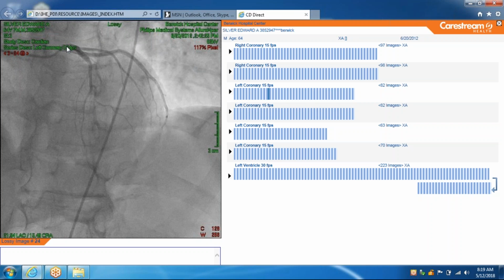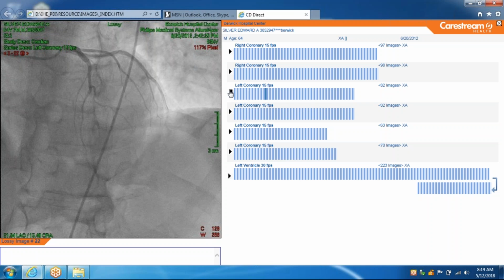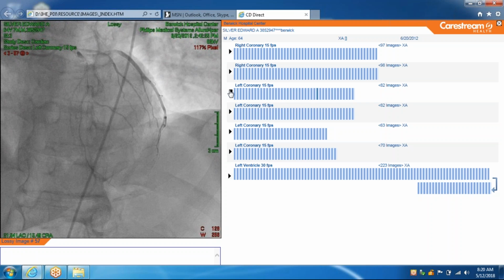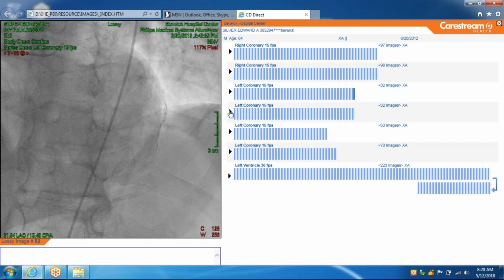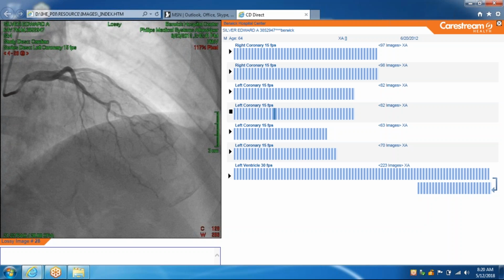Now the blood vessel that loops around the back of the heart is the left circumflex. So the left main coronary artery divides into the LAD, left anterior descending coronary artery, and a left circumflex, which is right there. So let's play it, and again, we just inject contrast, and it outlines the blood vessel. So you're looking for obstruction, okay? You have to get multiple views as well.